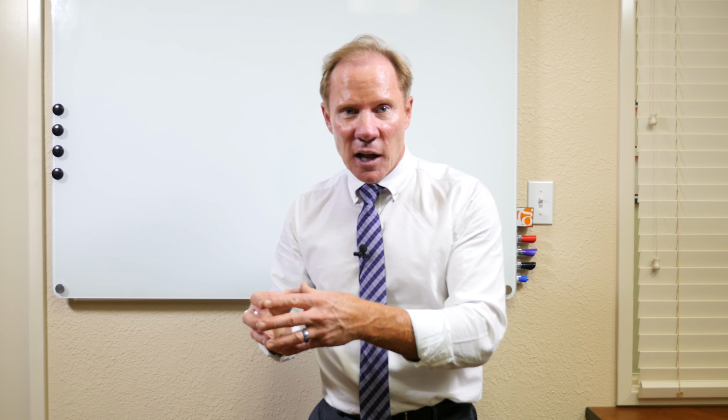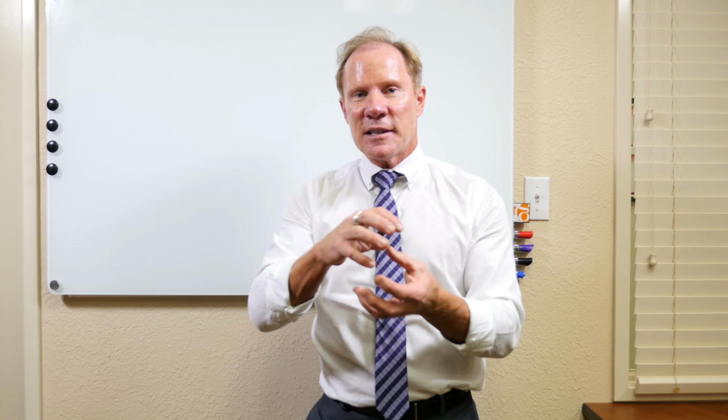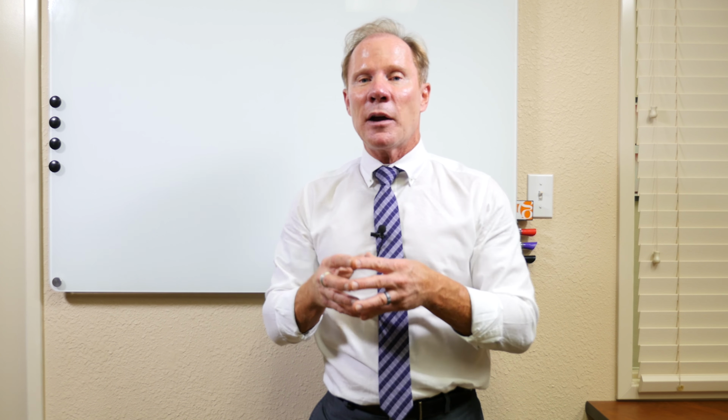Hopefully you'll get a chance to look at TheraCal LC. These bioactive, or regenerative, materials are going to change the way we do dentistry in the future. Imagine if we could have a cement for our crowns or a restorative material that actually interacted and remineralized the tooth at that microscopic roughness between the restoration and the tooth. As that demineralized, we'd have this interaction. These restorations could actually repair themselves.